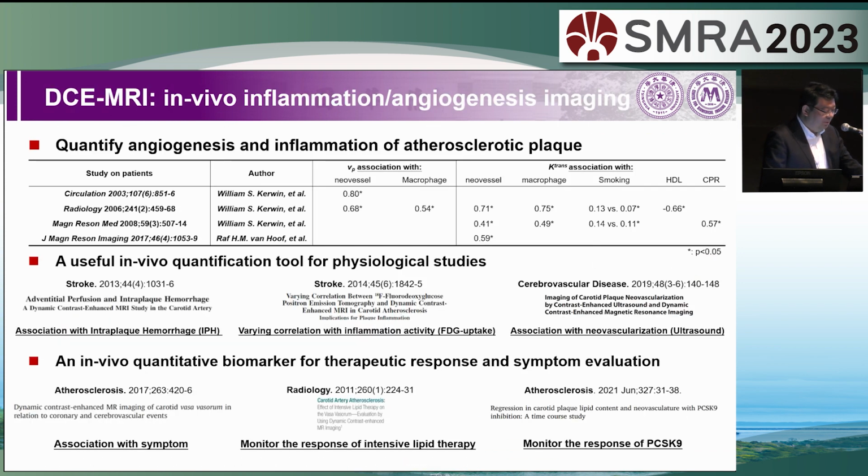It has been proven to be a useful in vivo quantification tool for physiological studies, and it also can be used for therapeutic response monitoring or correlation with symptoms.